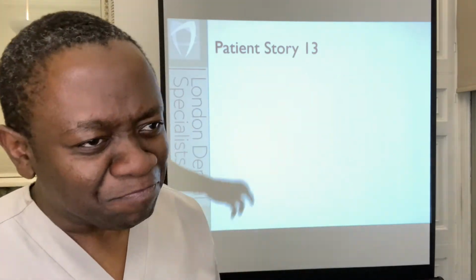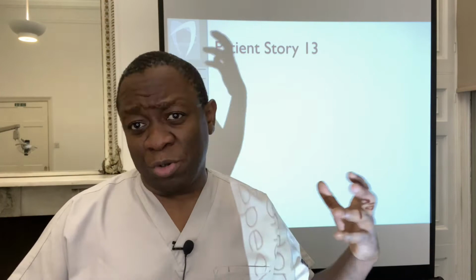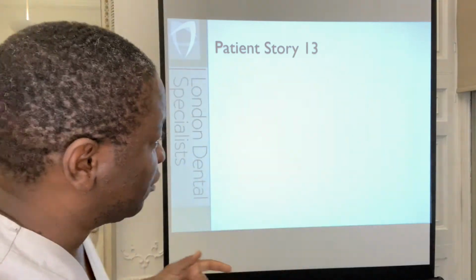So let's get into today's presentation. You will recall from yesterday that I said I was presenting half of a case where the patient was referred to see me because she had a cyst in the lower left and generalized gum and implant disease. So we talked about what we did in that case, and today is going to be what we did for the rest of the mouth.